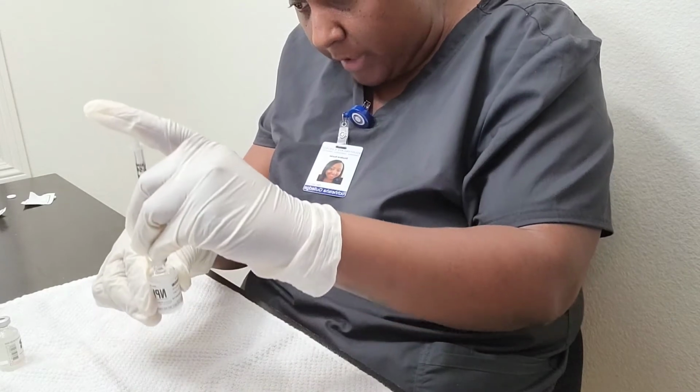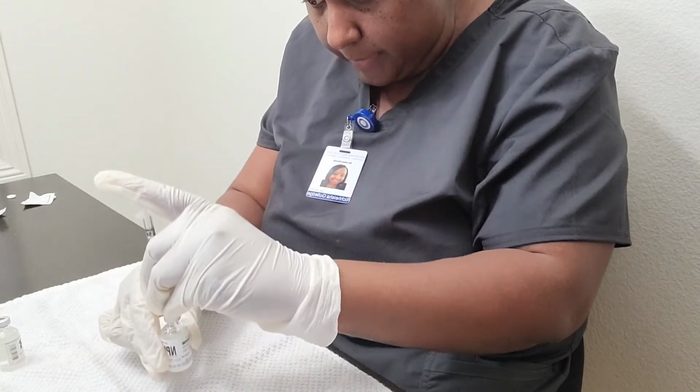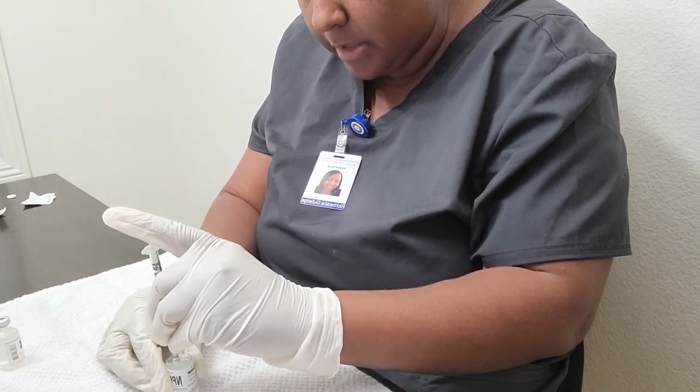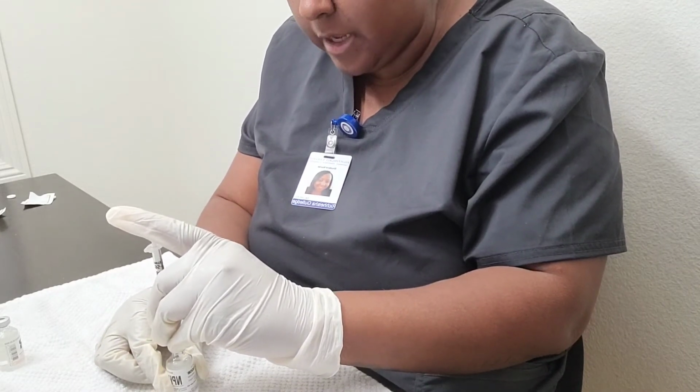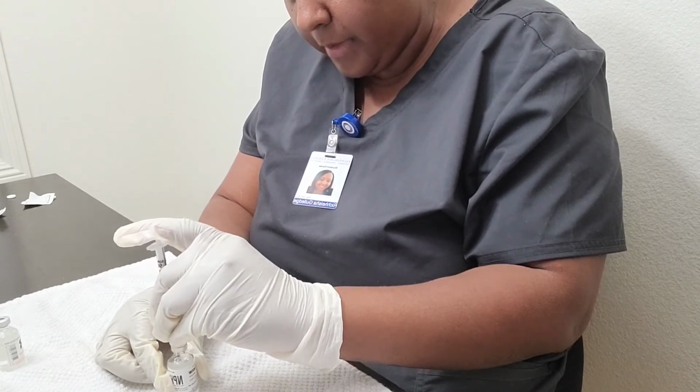Making sure that the needle is not touching the liquid, the medication, which it is not, I'll go ahead and inject the air. Okay.